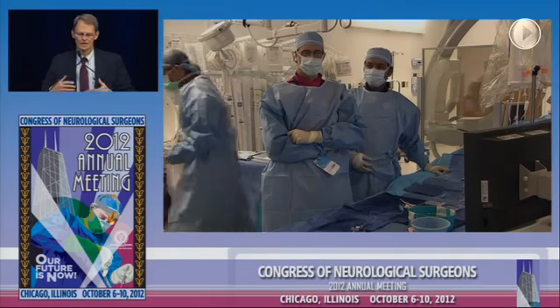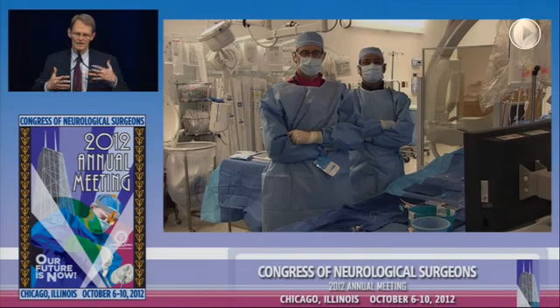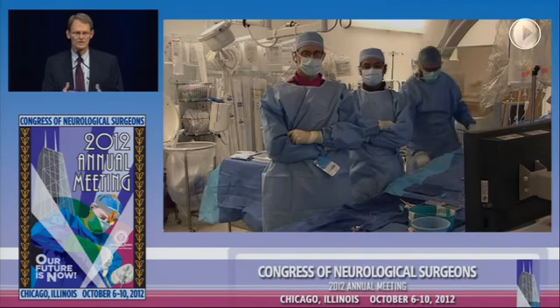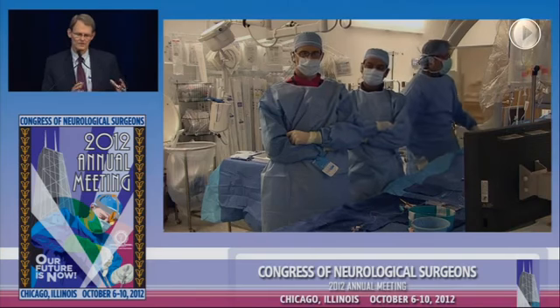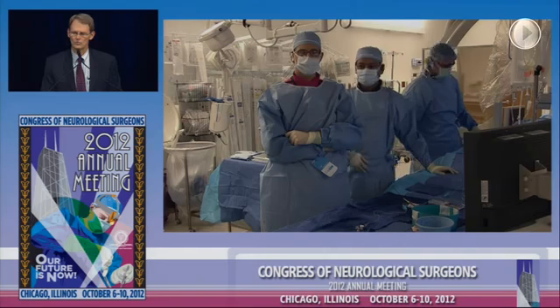We're seeing an idea turn into a product that gets approved by the FDA. This one just got approved. Basically, we're now still in trials. We need to keep studying these patients. We need to keep recording the data so we learn more and more. But all in, it seems like we've, at least for some aneurysms, we've really got a whole new world here.